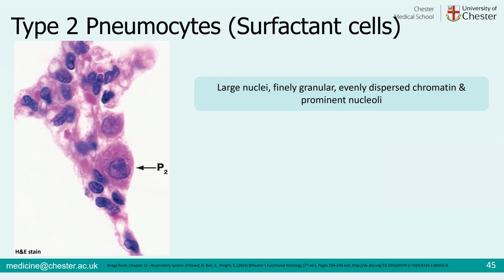It's dispersed throughout the nucleus, which gives it this evenly dispersed staining pattern. And although it's not very obvious in this one, we sometimes see prominent nucleoli. The nucleolus is where we have manufacture of our ribosomes. So when we have a very active cell in terms of producing a product, we need lots of ribosomes, where we will then see protein manufacture.